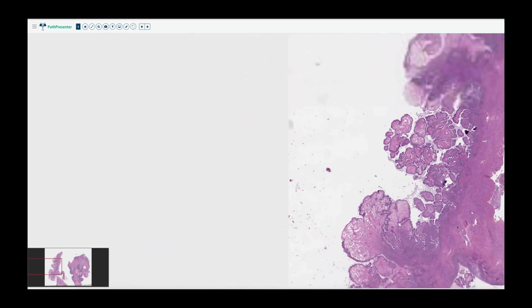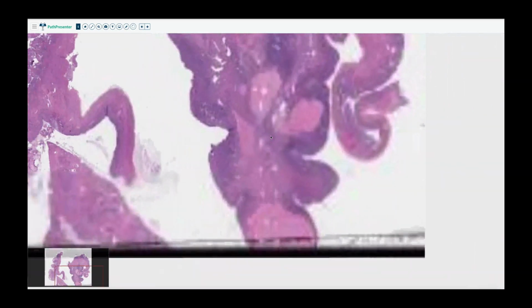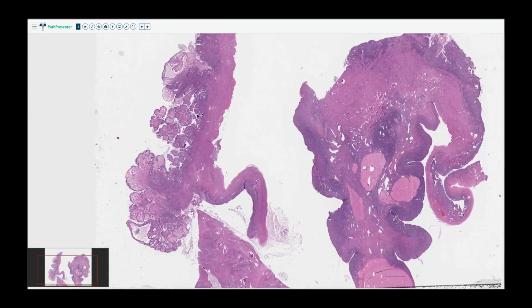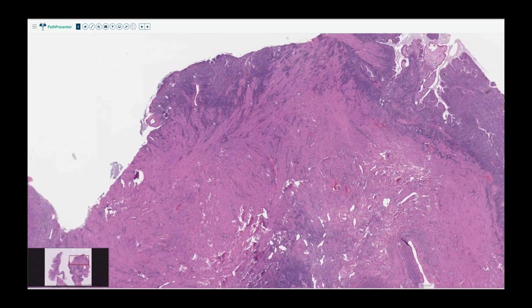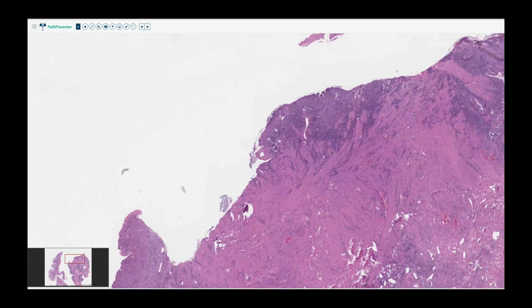And then to close up, we'll talk about seromucinous tumors of the ovary. I don't know why this slide isn't really loading. There we go. And so first, like I said, I usually like to get my orientation, try and figure out where I am. And on the left, I see stuff that looks more like borderline tumor. On the right, I see something that looks more like ovary. There's a corpora albicans. And if I zoom in, actually, it looks like there's a little bit of whatever this is here. So probably whoever grossed this saw some papillae, and that's why they stuck that section in as well.